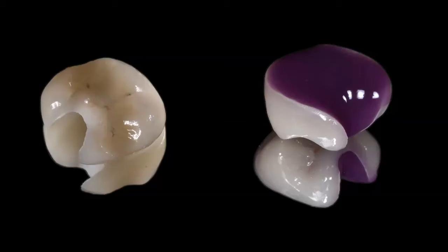You're going to put it in that container with either isopropyl alcohol or distilled water, and you're going to ultrasound it for 5 minutes. You're going to get it out, you're going to bone dry it, and now you're going to silanate that intaglio surface. So once it's silanated, remember what I said initially, you can then go ahead and try your restoration in, because you've already protected your etched surface with the silane.